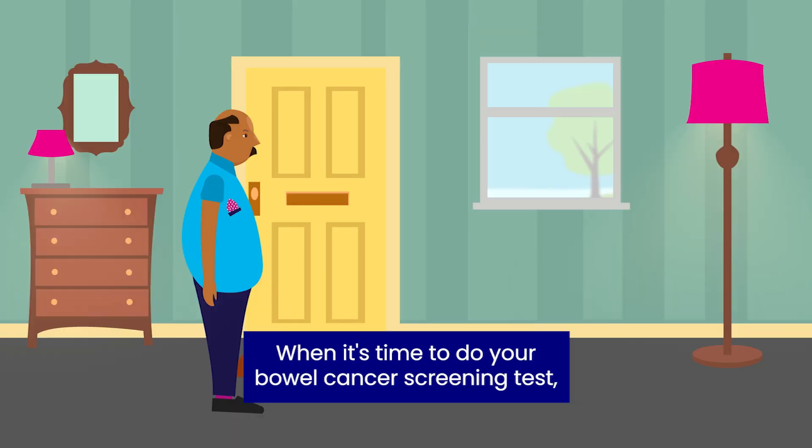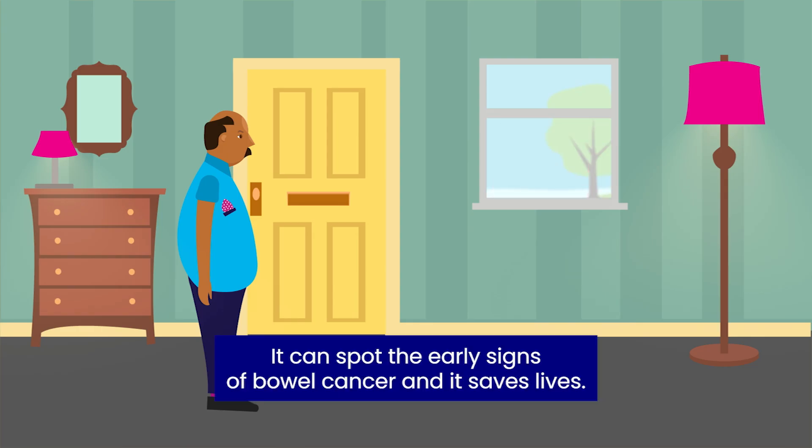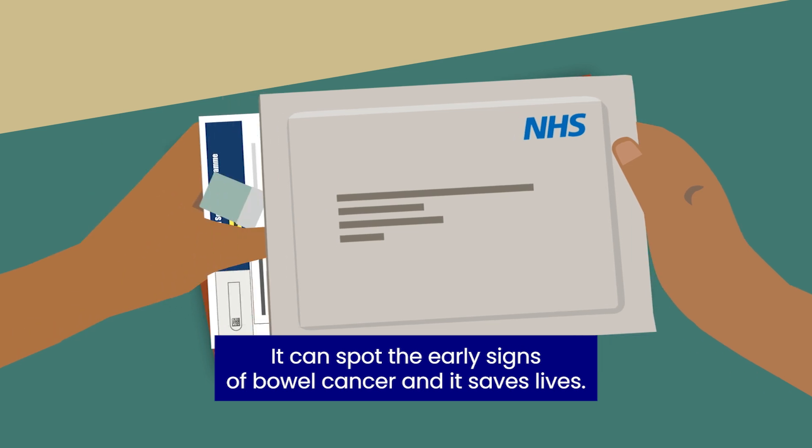When it's time to do your bowel cancer screening test, you'll get a kit through the post. It can spot the early signs of bowel cancer and it saves lives.